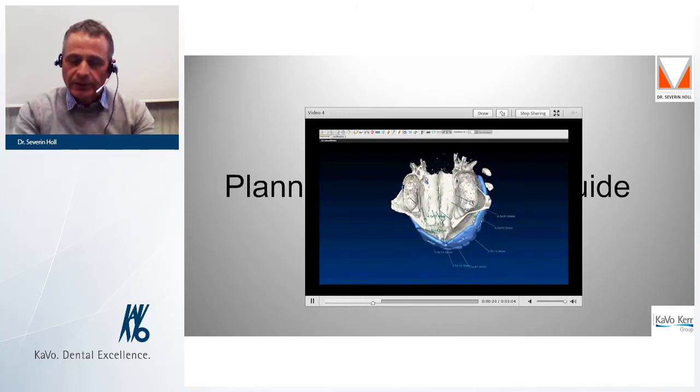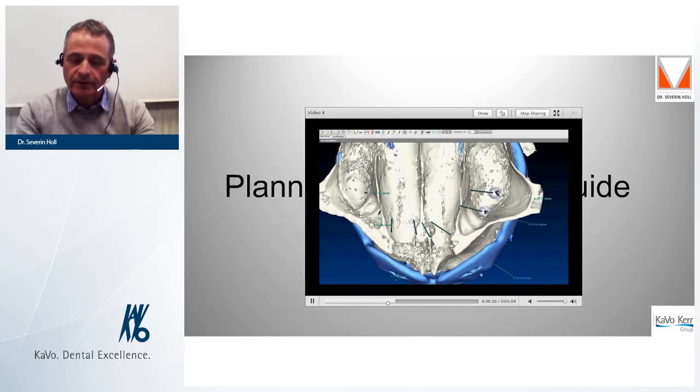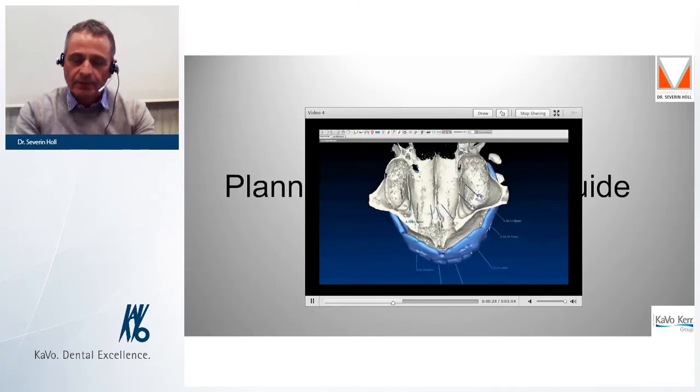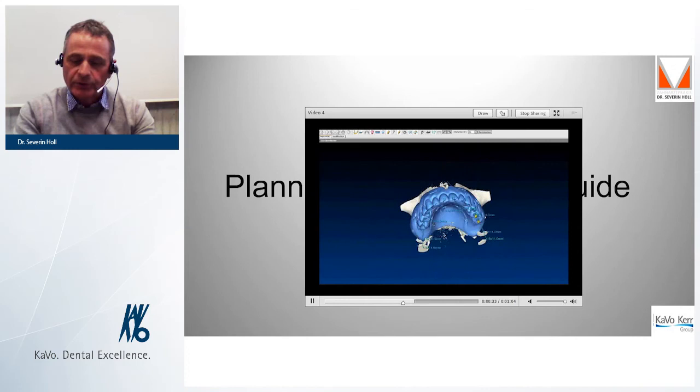In the left maxillary sinus, you can see the planned internal sinus elevation. Recognize the tooth-determined implant positions with 8 implants.